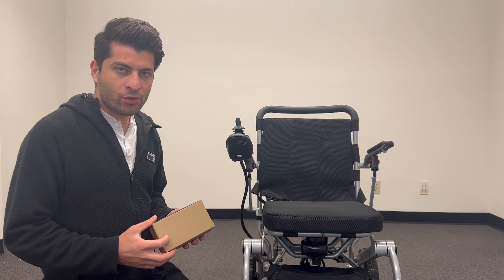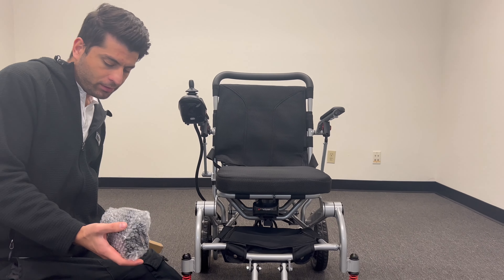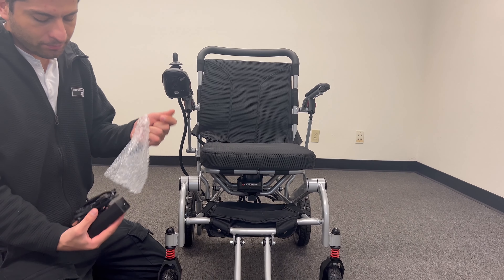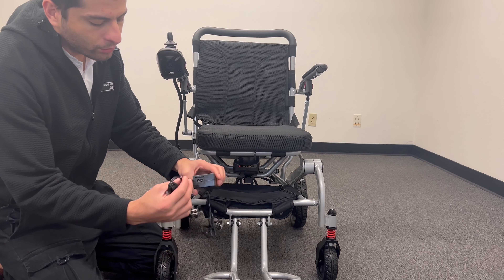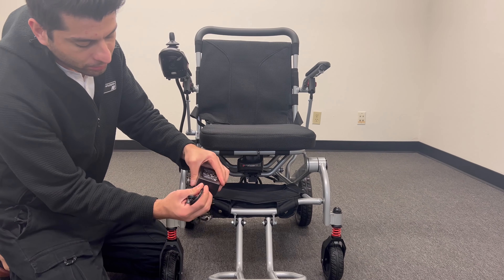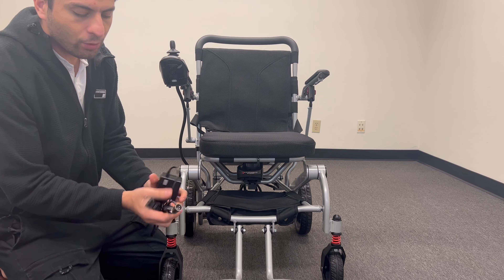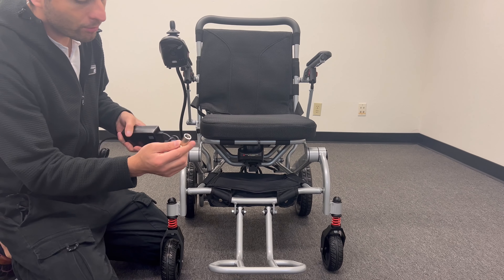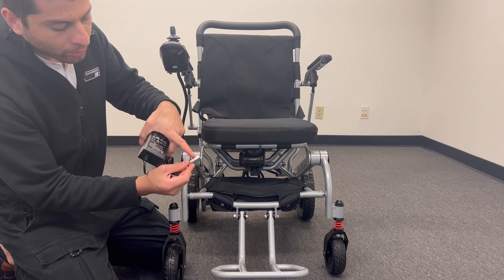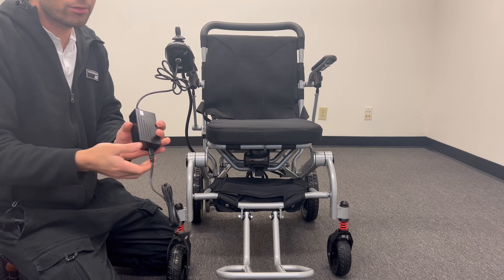I will show you how to use the charger on the D6 wheelchair, right here. You will receive two pieces and you need to plug in right here. After that, just check where it connects on the joystick right here. You will see the arrow on it and then put it at the top. And it's ready to charge now.